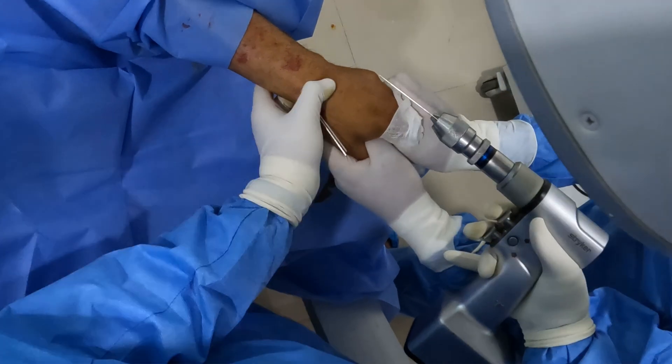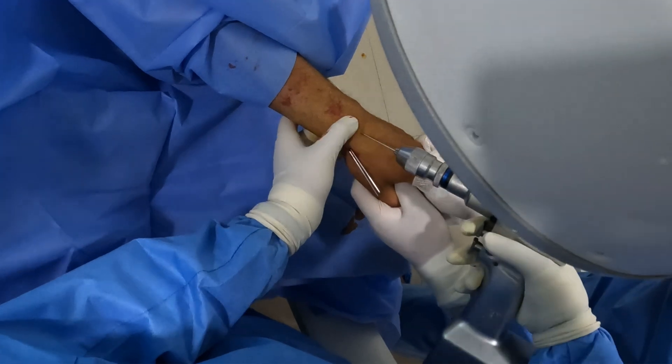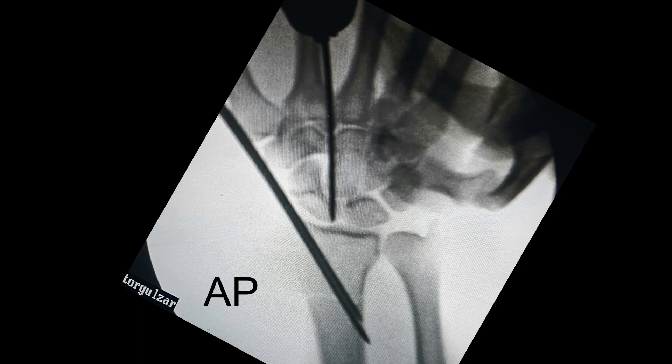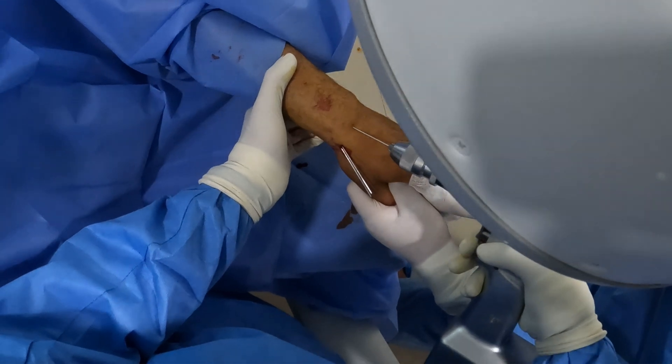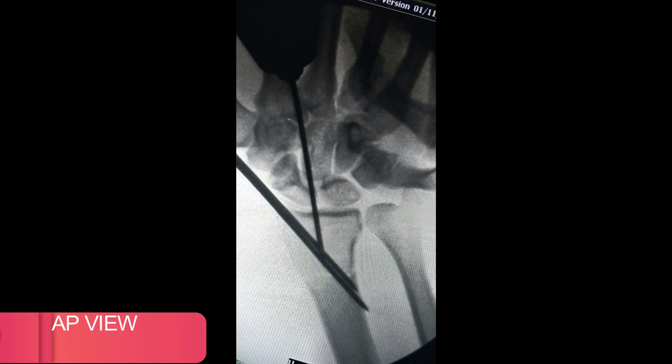I'm palpating Lister's tubercle and I'll place my K-wire, taking the help of C-arm to confirm the starting point. This looks like a suitable entry point for my third K-wire, which will go from the dorsum into the volar surface of the radius across the fracture site. I'm entering in small bursts and I'll check the trajectory of my K-wire in the AP view.